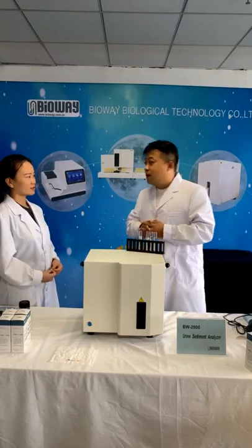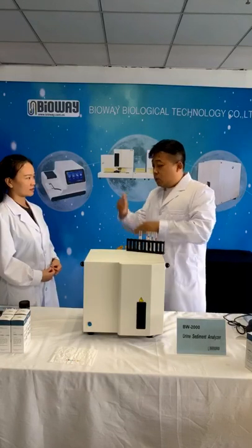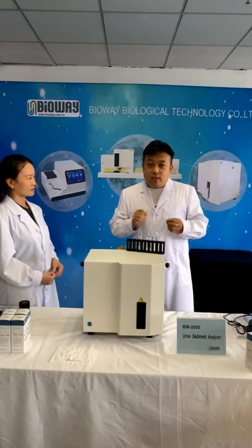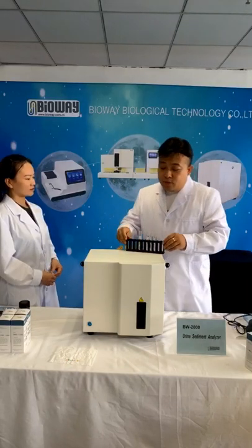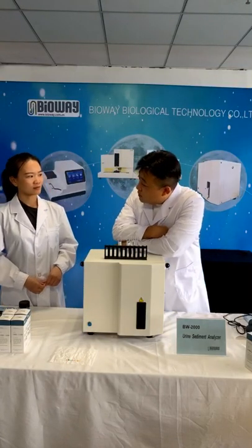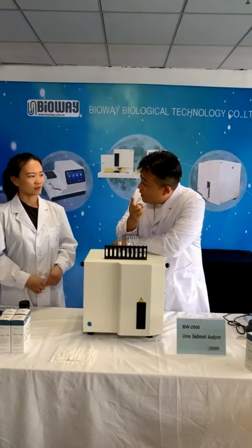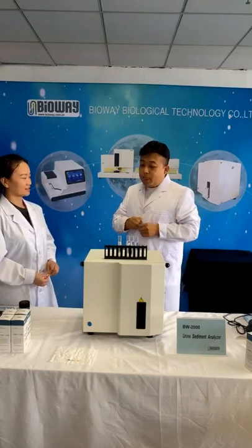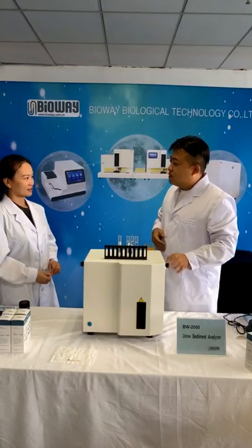That is the golden standard, for the result comparing with the centrifuge. Even for the centrifuge, in the world now there are two directions. Do you know what the two directions are? One is 20 and one is 40. Do you know what the difference is?